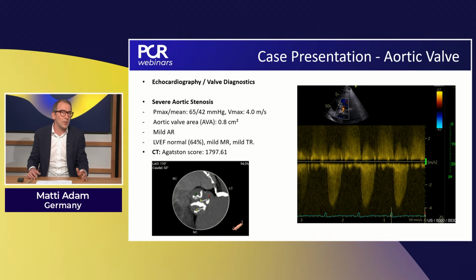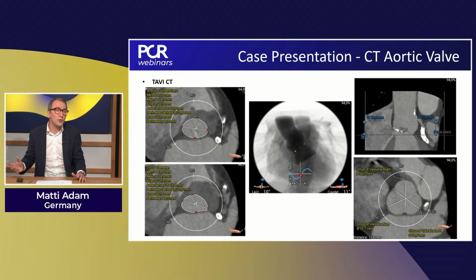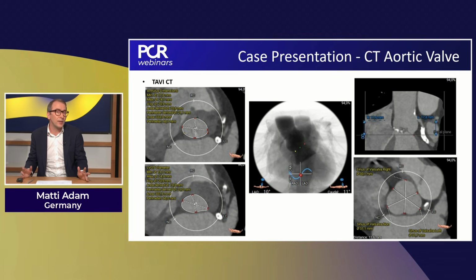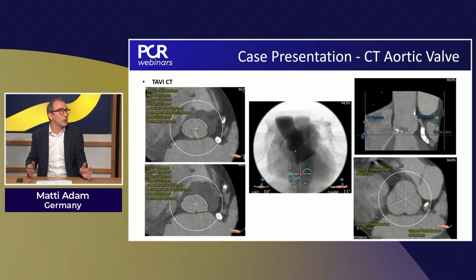And there is calcium. Calcium score here is 1800, and I do feel there's severe calcification patterns, especially on that one leaflet, and so really, let's say classical aortic valve stenosis involving calcium. If you look further measuring in CT, you'll see it's a 21.1 perimeter-derived diameter. The LVOT is tubular, same size, 21. Angulations look good. Coronary distances are good. You see the stent and the LCX there sitting nicely, and wide sinuses. So here I'd say nothing super suspicious to report.